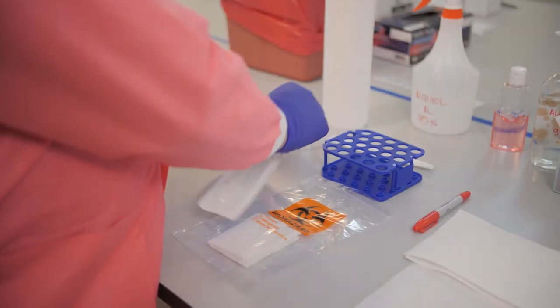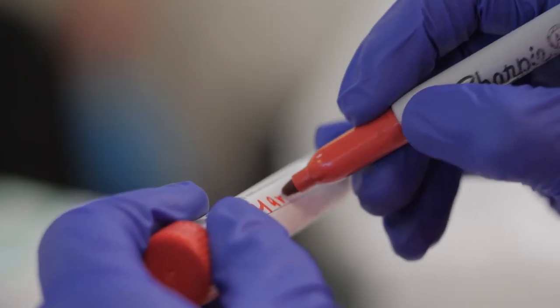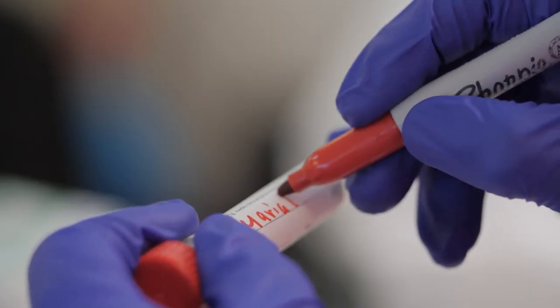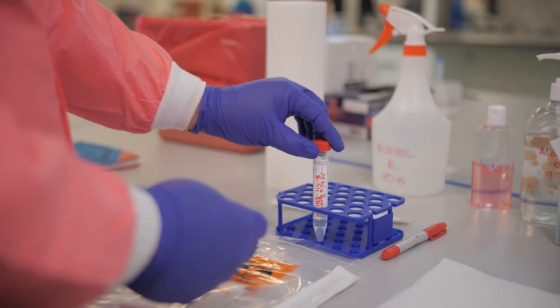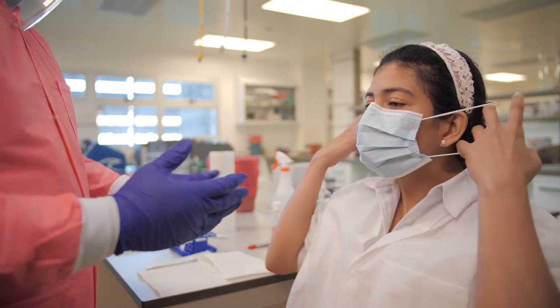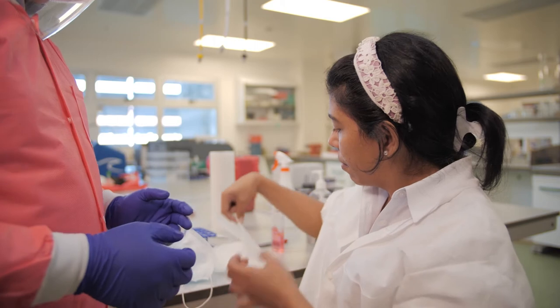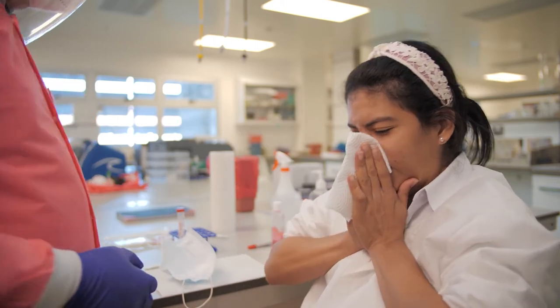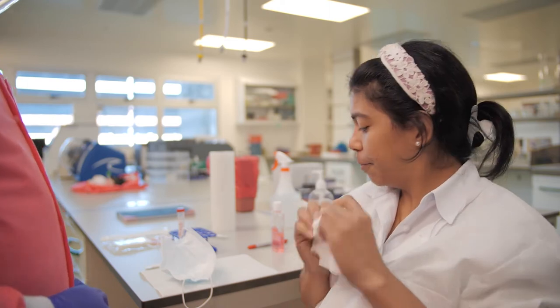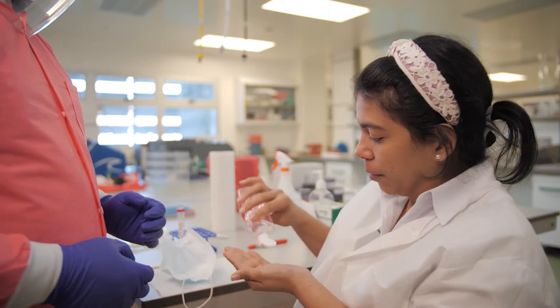Open the package and remove the viral transport tube and label it with all patient information, including the date of sample collection. Ask the patient to remove the mask and place it on a tissue or paper towel. Then ask the patient to blow their nose and dispose of the tissue in the bio-waste bag. Offer alcohol gel before continuing with the procedure.